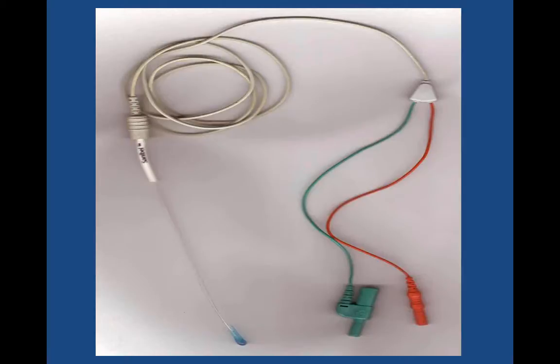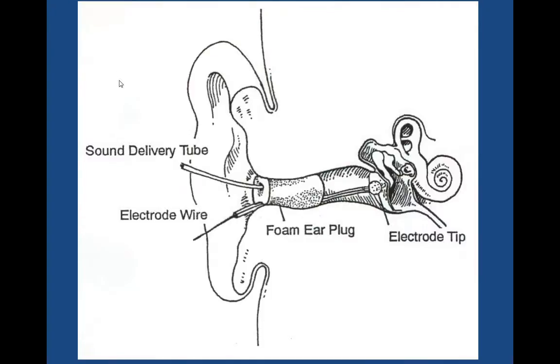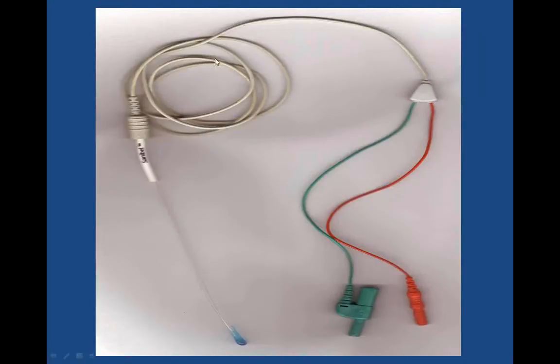Obviously, what you need in addition to the electrode is a specialized cable that it attaches to. This cable allows you to not only plug in the active wire lead from the electrode into its appropriate jack in the preamplifier, but it also allows a common or ground connection that grounds the shielding of the cable, which helps prevent some electromagnetic artifacts from jumping onto the electrode. We found that a very useful feature to have with this cable. So again, it's a specialized cable. The cable, of course, can be used for a long time. The electrodes are designed to be disposable.